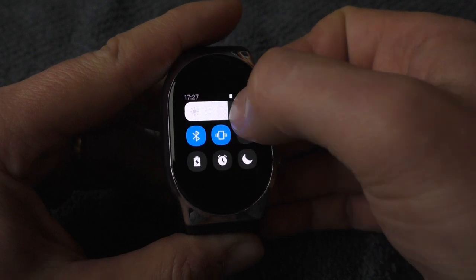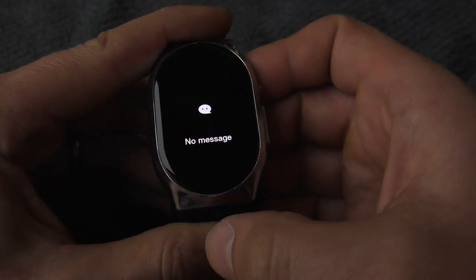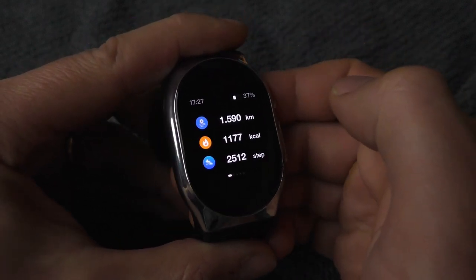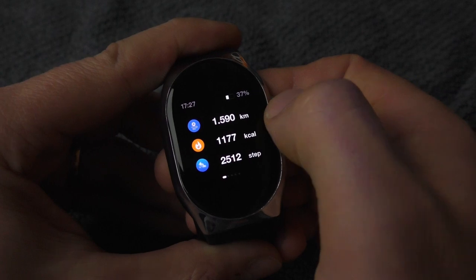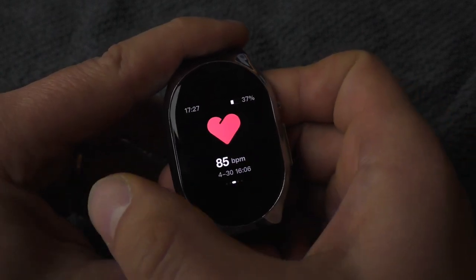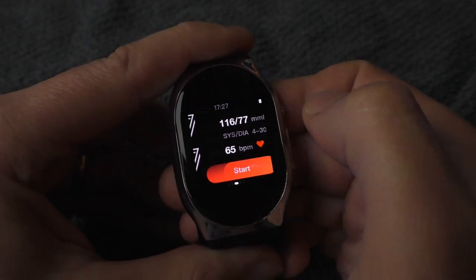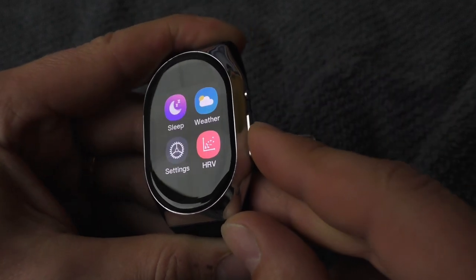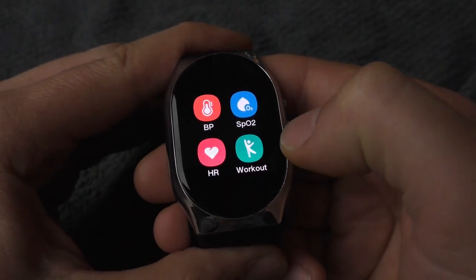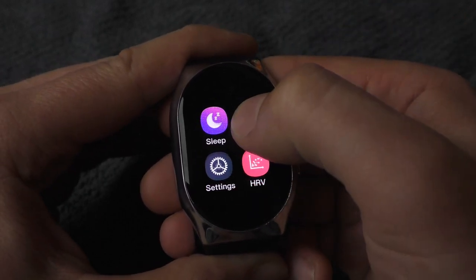This watch is very easy and simple to use because it has similar menus to the phone. Just swipe down to adjust the brightness and some other functions. Swipe up to see messages if you have connected it to your phone. Swipe right to see how many steps you have made. Swipe left to see the latest blood pressure testing, heart rate, and SPO2. To access the main menu, just press this big button, and here you can see all the functionality.